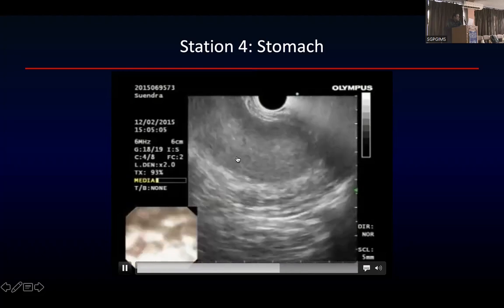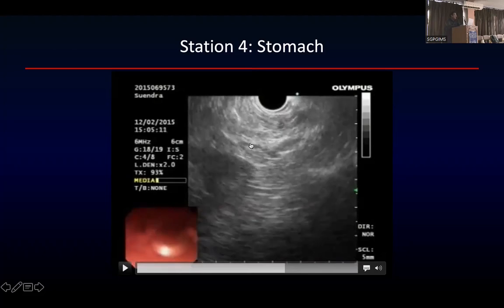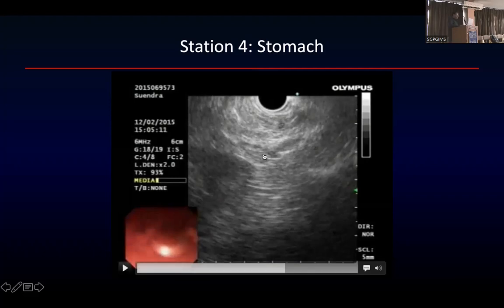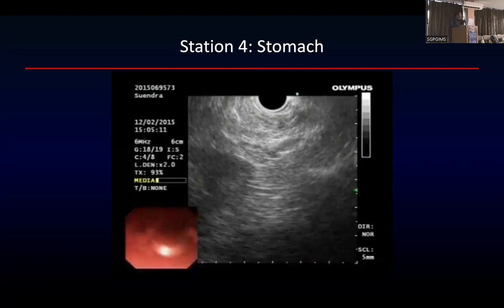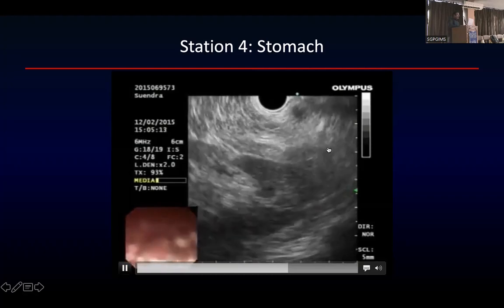You will see the kidney, and above the kidney you can see the adrenal. And this one, can you see this now? This is what the adrenal is. This is typically known as the flying bird sign or the seagull sign. Just above the kidney you will see the adrenal. You can easily take an FNA or a biopsy from an adrenal gland if required. Endocrinologists usually do it, but obviously you can do it very easily without any problem. So you saw the adrenal.